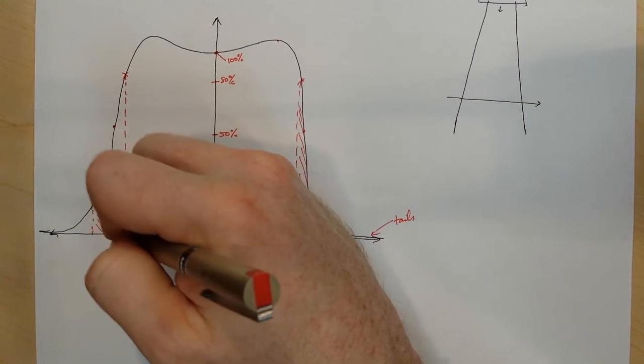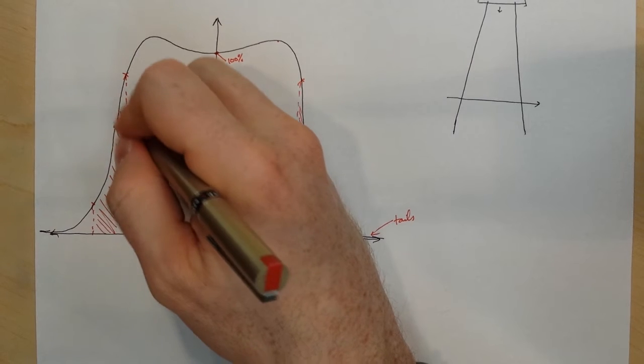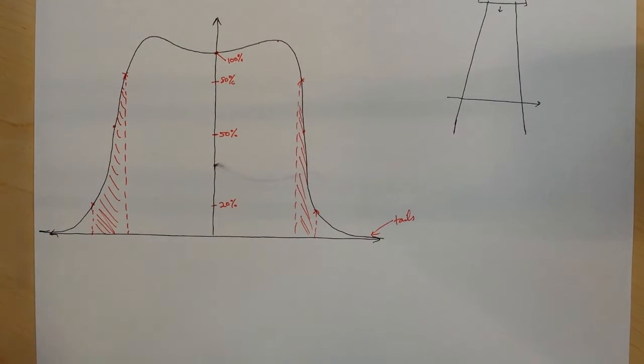In Khan, you'll read it that it's either 20 to 80 or 90 to 10, but most people use 20 to 80 because it's a smaller width than 90 to 10, and it makes your machine seem like it has a tighter beam. So when you talk about the tightness of the beam, the tightness of the beam is how small is the penumbra, because the penumbra represents the fuzziness of the beam, the fuzzy edge of the beam.